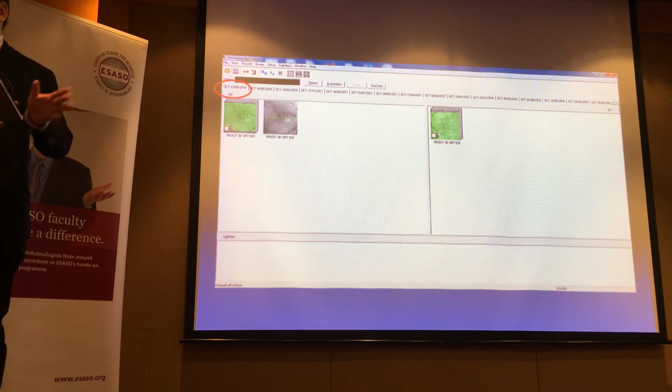I was like, wait a minute. Because I remember her, she's my patient, I'm seeing her every month at that time. So I remembered roughly what her findings were, and I said, it's definitely better, clinically. Especially compared to what I documented in the notes. But when I looked at the OCT scan, that was wrong. It was terrible, it was bad, it was fluid.